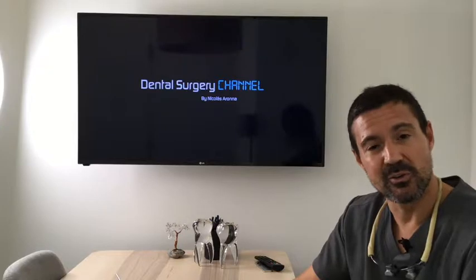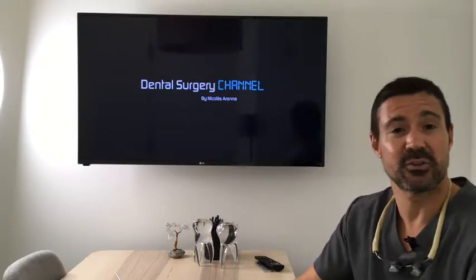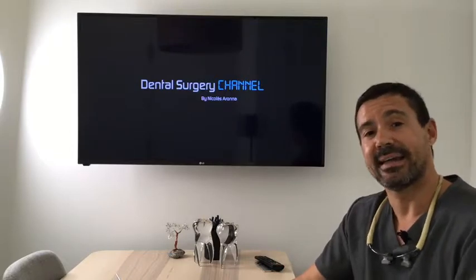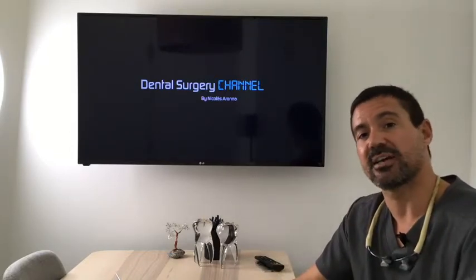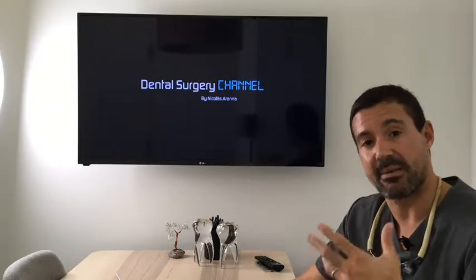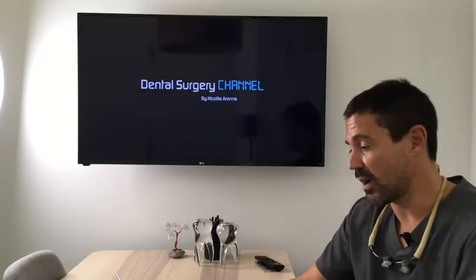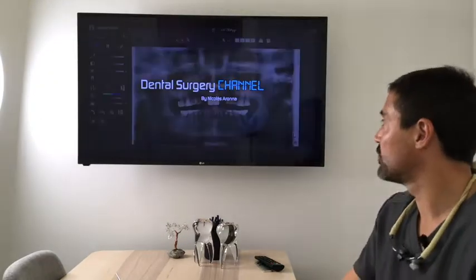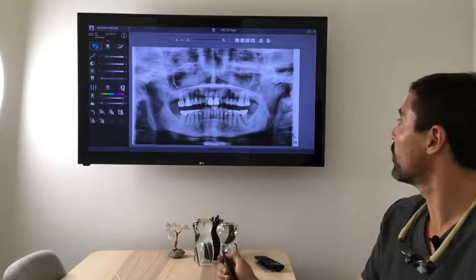Today I want to share with you a case that was recently treated with two central incisor crowns, and one of the other areas that she had to treat was a molar that was affected because of a big abscess that she was having. So I want to share with you the case, and the patient actually came to the office like the one you see.